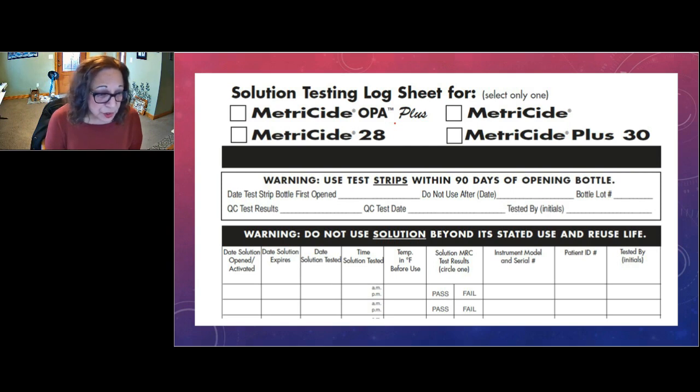In an ideal world, you would know who that device was used on that you're preparing to soak, so that should that patient come back and say, hey, I have an infection, it's all because of you and your practice, then you have clear documentation that everything was done properly, everything tested right, the item was soaked for the proper amount of time. It helps protect you and your practice.